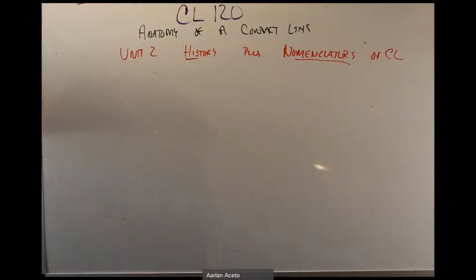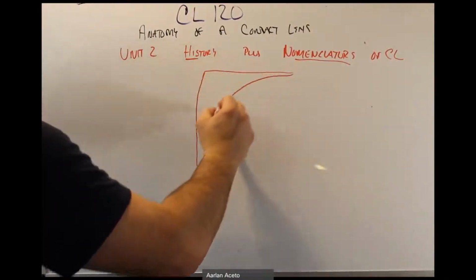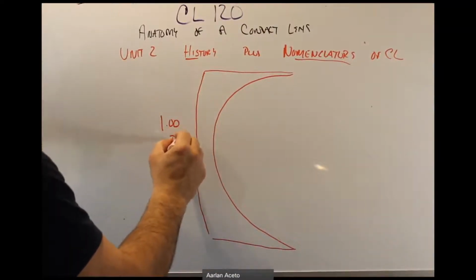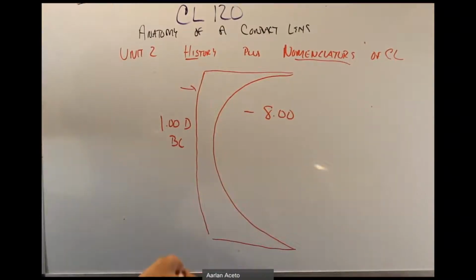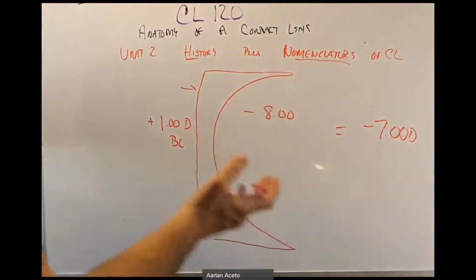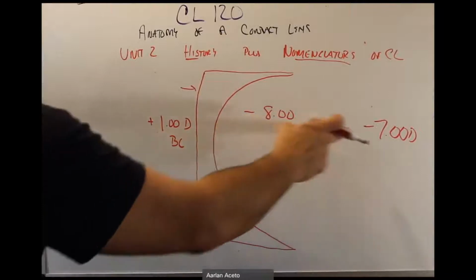how they work, what the powers are. But in a nutshell, you guys already know that if I had an ophthalmic lens that was a +1 diopter base curve on the front surface, and a -8 on the back, you add the two algebraically, and you get approximately a -7 diopter lens. And front versus back, obviously there's something to do with the thickness or the index of refraction, but in a nutshell, the real basics are a +1 -8 gives me a -7.